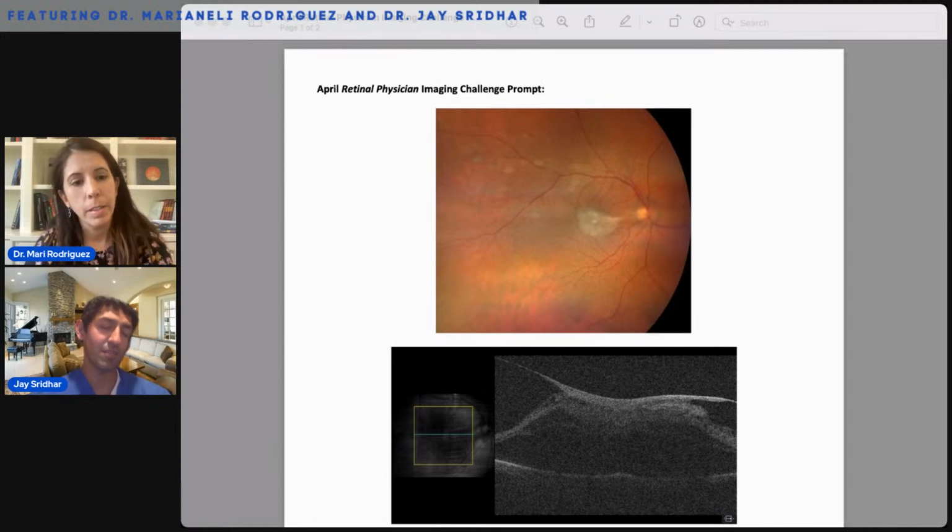Yeah. So the other point I would make, Mario, before we move on, and I forgot to mention this earlier, one of my attendings in fellowship taught me this, and I'm sure you heard this too when you trained. I think most ERMs are idiopathic. You look in the periphery, the retina is fine, there's nothing else going on. But I would always recommend a good peripheral exam, because the number one thing that could be a cause would be a retinal break, a localized detachment. I've had ERMs referred to me as pure ERMs where I've done a peripheral exam and I found a tear or localized RD. And that's huge to know as a surgeon going into surgery that I might actually encounter a problem in the periphery, or I may have something else, if the ERM is not significant, that I could treat in the clinic.